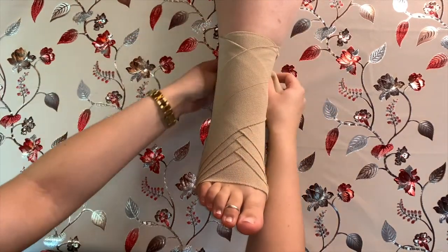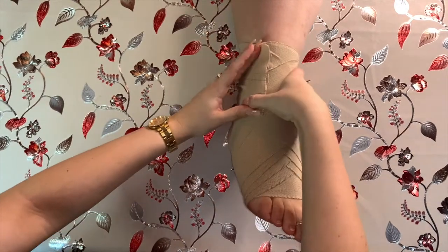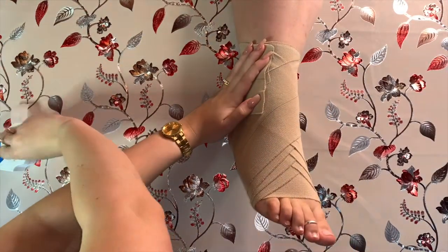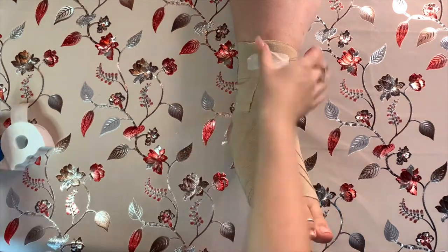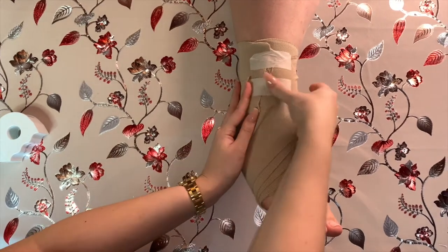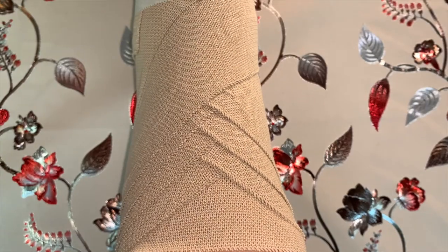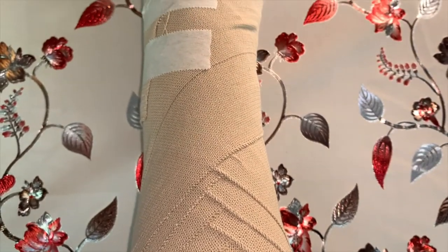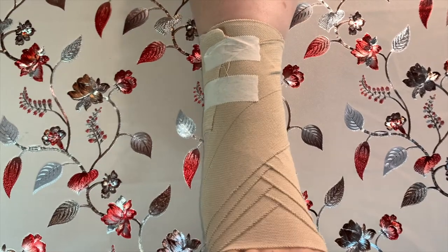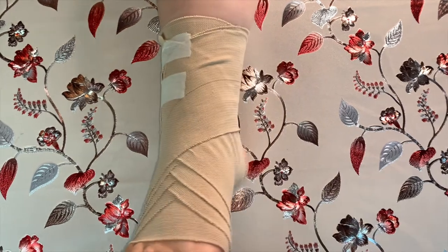Continue this figure-of-eight pattern until you get close to the end of the roll of bandage. Then wrap the end of the bandage up and around the back of the leg just below the calf, and keep it in place using the clip or cloth tape. And there we have it — a properly strapped ankle using a compression bandage.